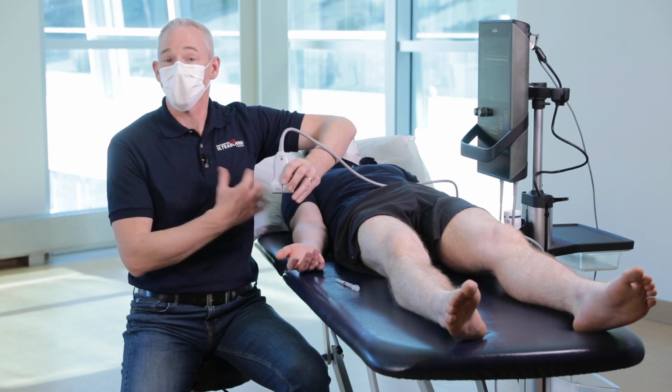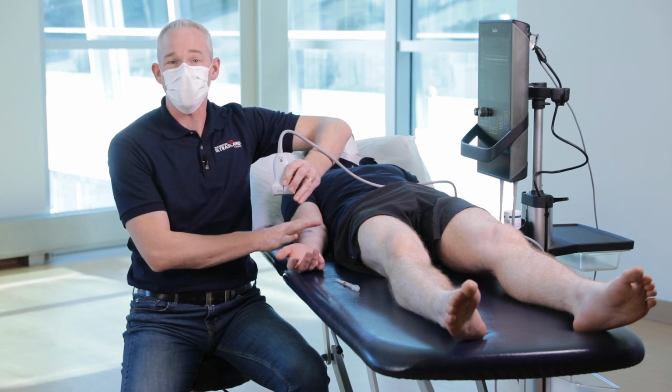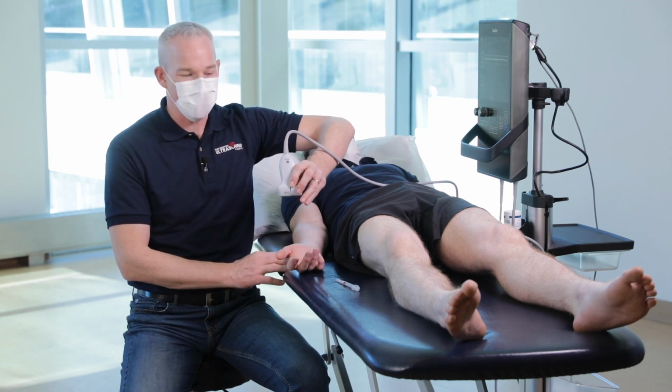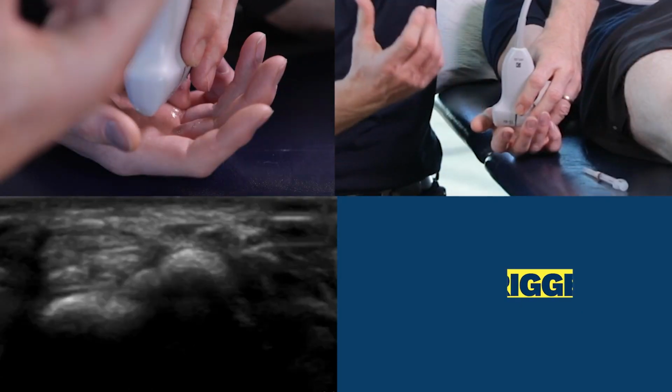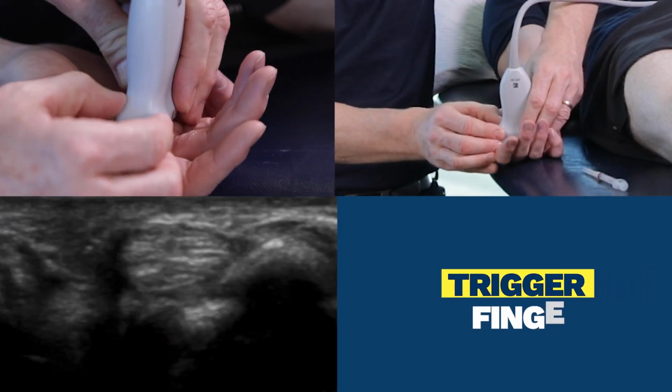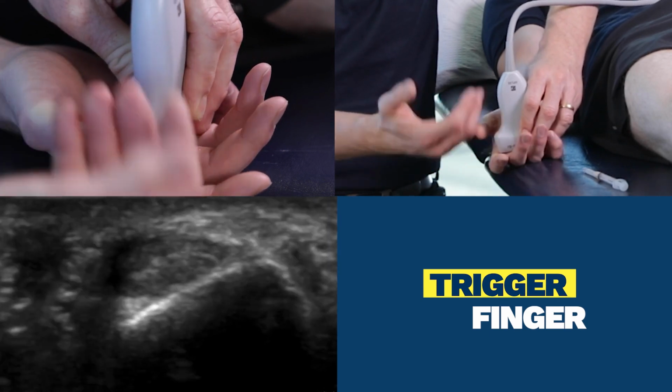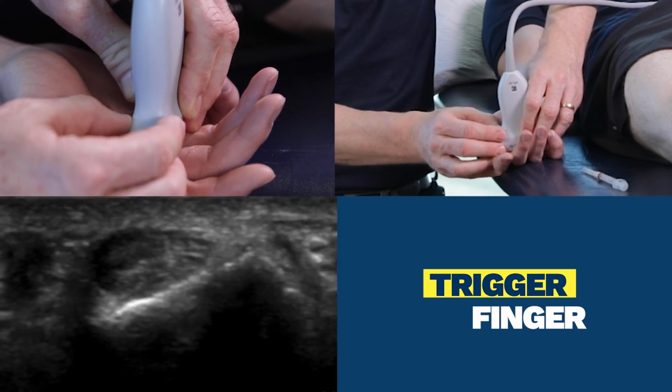The patient position for us at Sport Medicine Ultrasound Canada is supine with the palm up, although some practitioners may prefer the patient seated across the table from them. The landmark is the distal metacarpals. Here we see in view the third metacarpal. The orientation of the probe is across the hand.